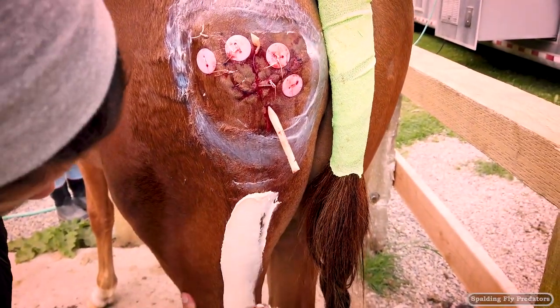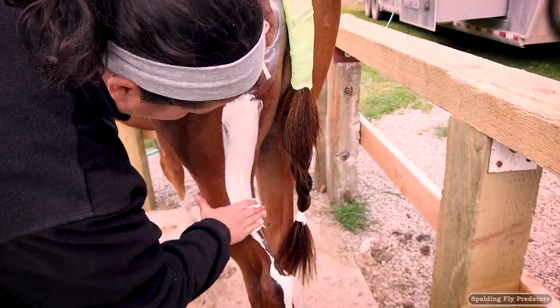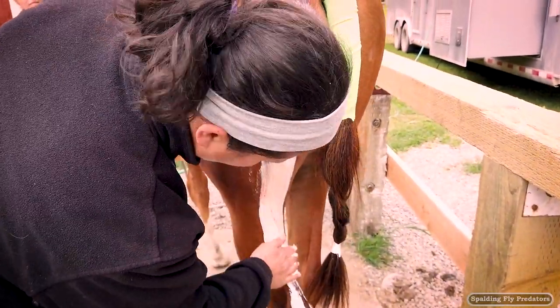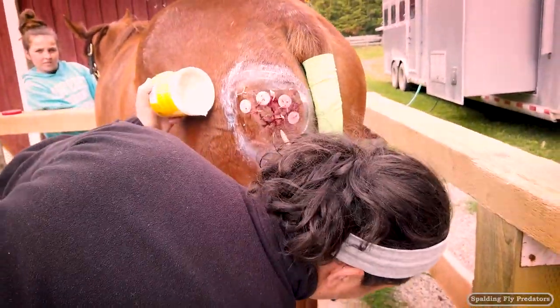We use a little bit of Corona down his leg — he's going to look like he's got war paint on, but that keeps the drainage from taking all the hair off. That'll just be a couple of days' worth, and then just keeping the local area clean should be enough.